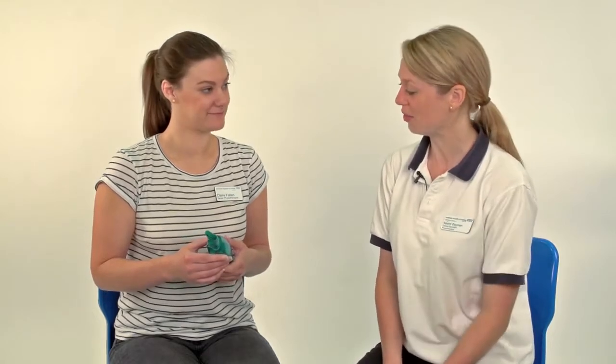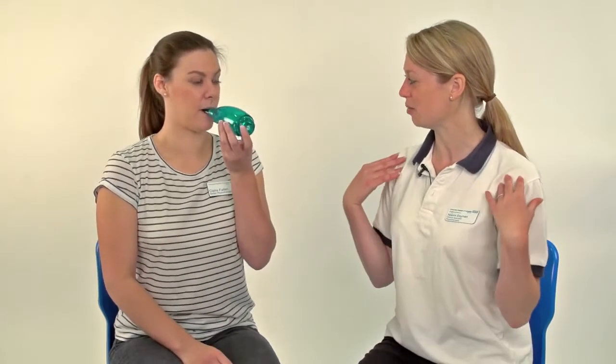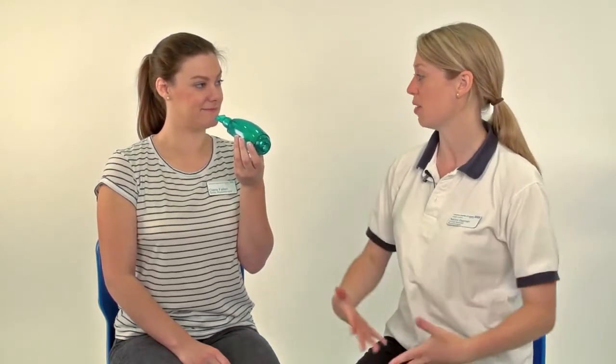What I'd like you to do now is 10 breaths. Pop it in your mouth, sitting nice and upright, shoulders right down and relax. Breathe in through the Acapella and then take a nice prolonged breath out — keep going and relax. You've got your cheeks nice and straight, because sometimes due to the oscillation you can make your cheeks wobble and scoop air into your mouth. We want to make sure we're breathing right from the very bottom of the diaphragm so that you're clearing all the way down through the lungs.